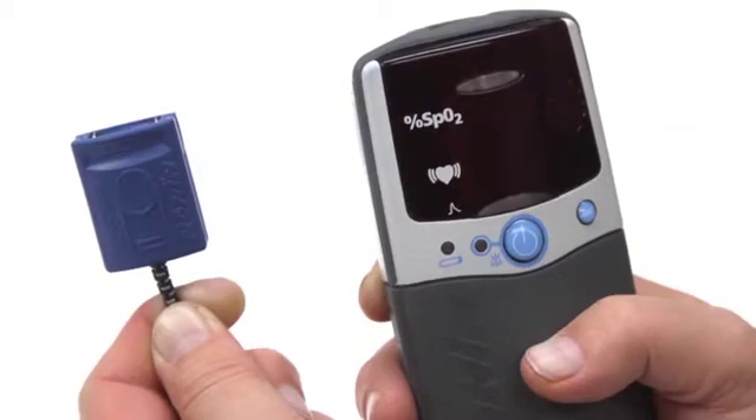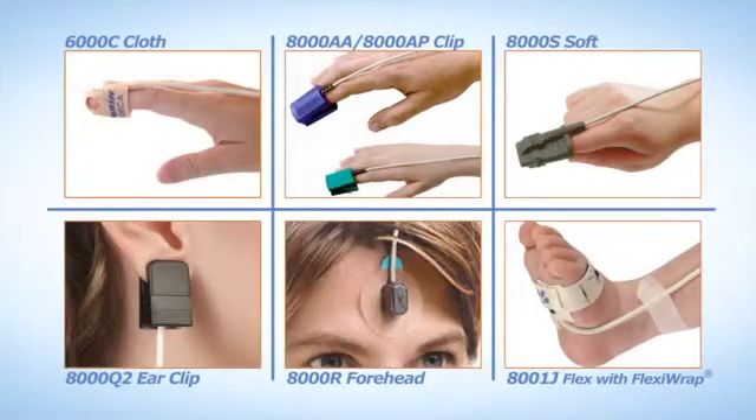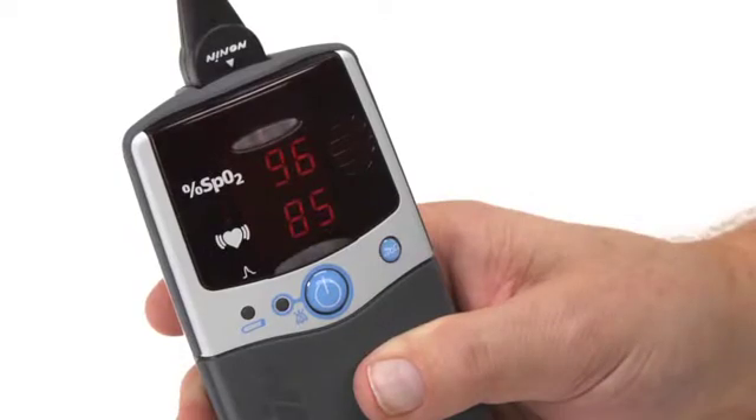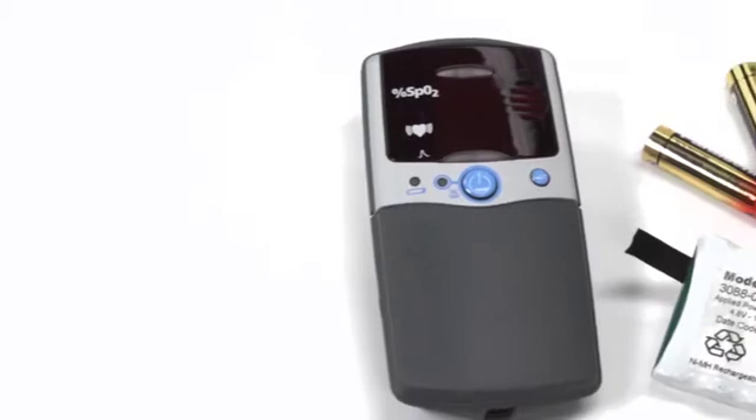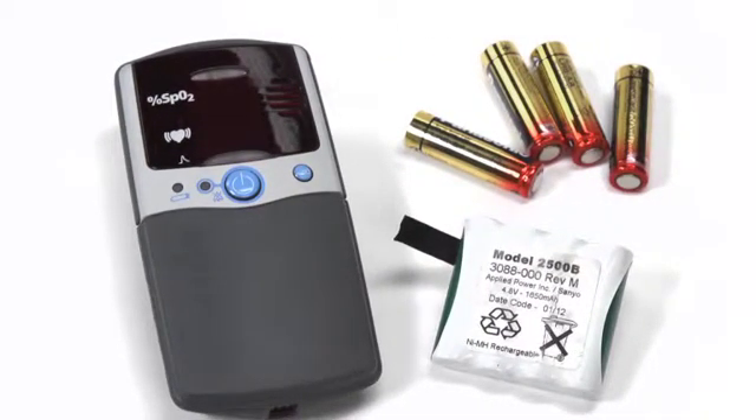To start, ensure the sensor you are using is compatible with the Nonin PalmSat oximeter. All Nonin PureLight sensor types will work with the PalmSat oximeter. The PalmSat oximeter is a good choice for both mobile and non-mobile uses. It is powered by either four alkaline AA batteries or a rechargeable battery pack, available from Nonin Medical.